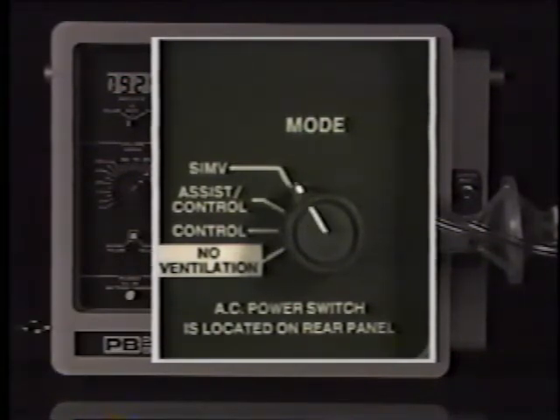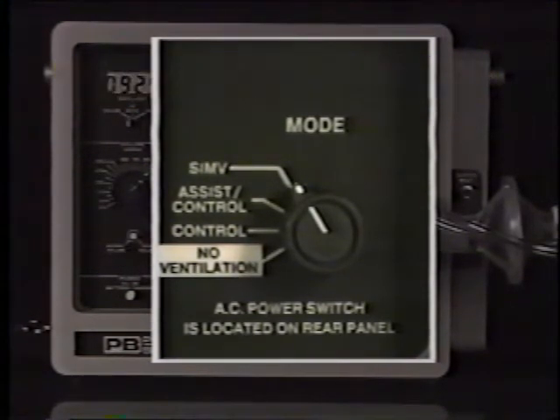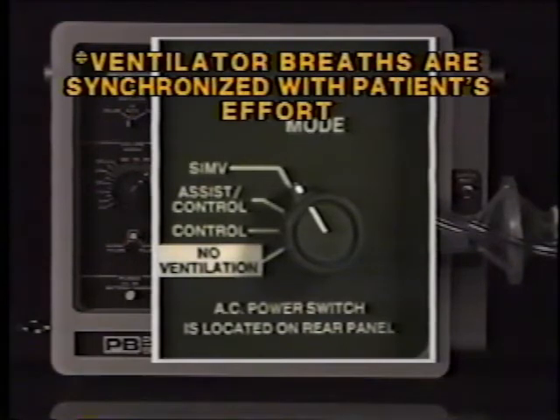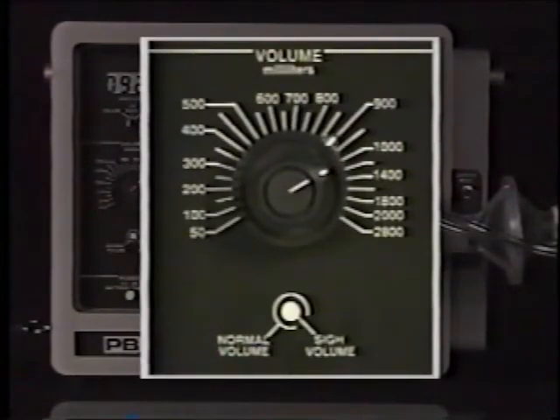The SIMV mode, which stands for Synchronous Intermittent Mandatory Ventilation, delivers a breath to the patient on a timed basis. While the patient sustains spontaneous breathing, delivery of ventilator breaths is synchronized with the patient's effort. The volume of air to be delivered during each breath is determined by the volume control. The volume scale provides a general reference for the volume setting.